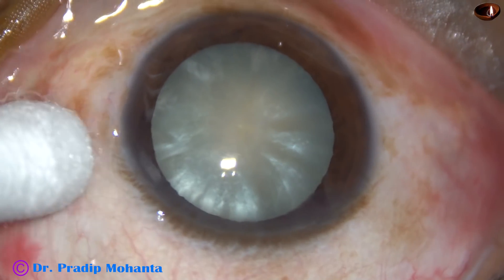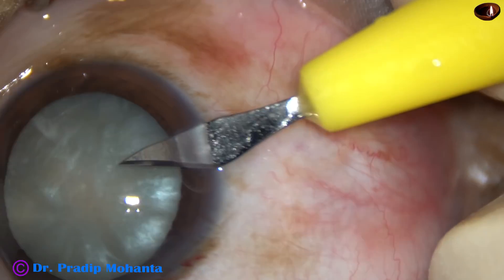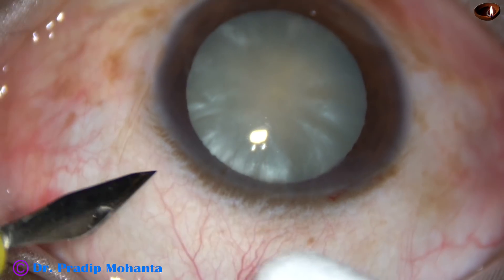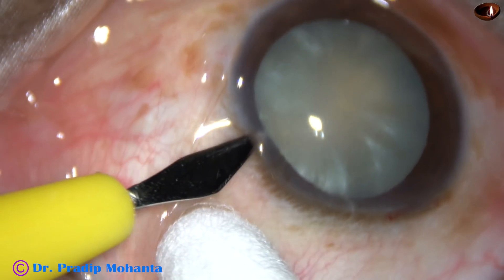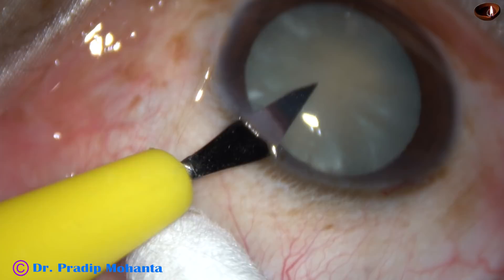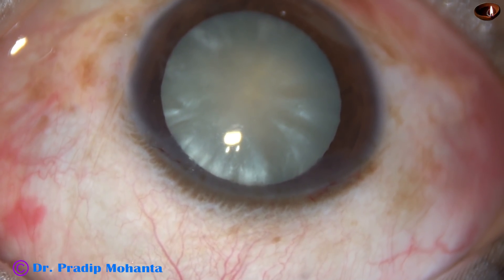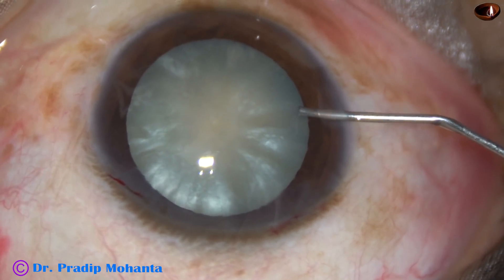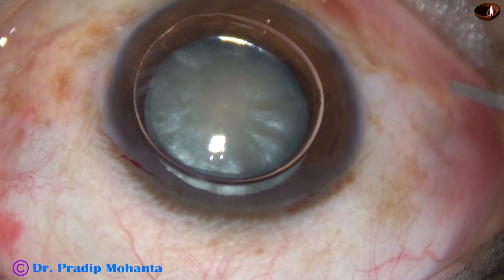This is an intumescent cataract. The main challenge in intumescent cataracts is capsulorhexis because of high intralenticular pressure. In intumescent cataracts, the rexis tends to run to the periphery because of high intralenticular pressure. So, if we can reduce the intralenticular pressure by some means, the surgery will be very easy.